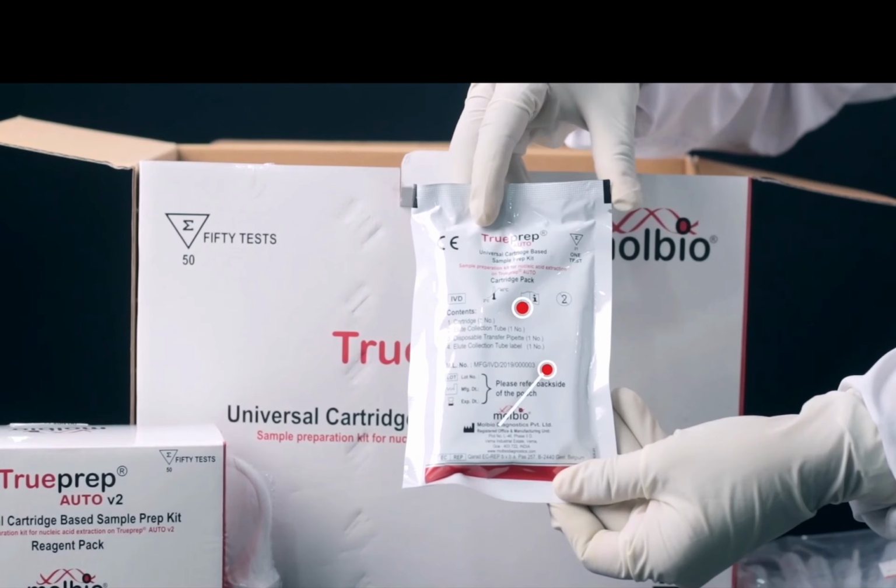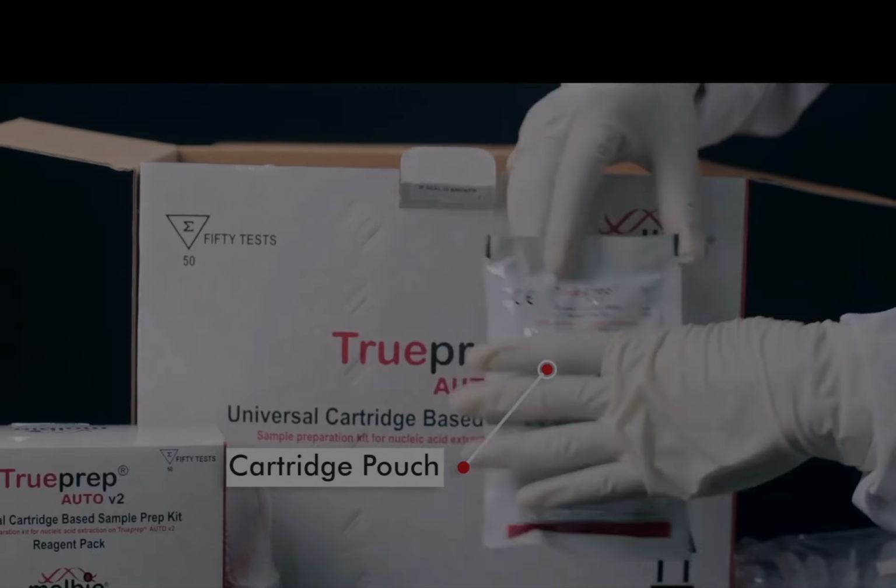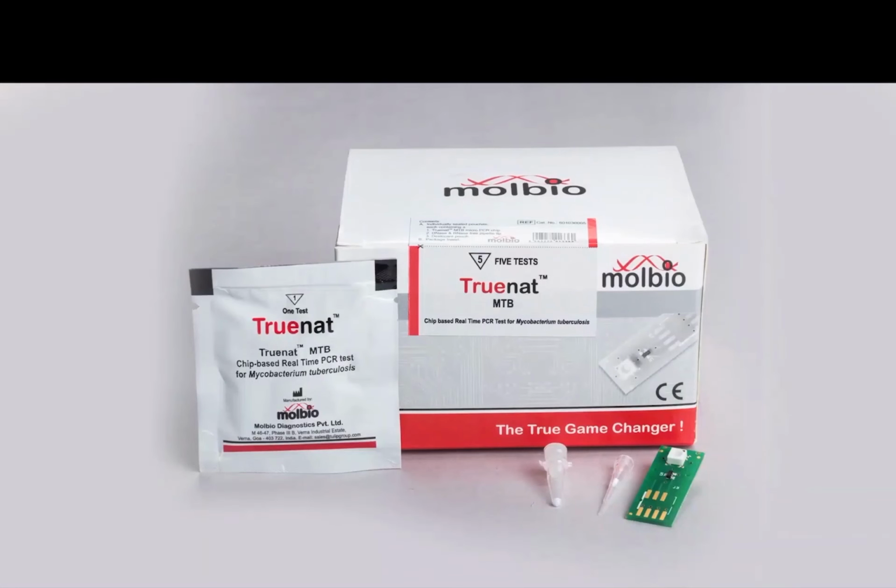And this is the cartridge. We'll be seeing how it looks, a cartridge in which the extraction occurs. Once the DNA extraction has occurred, now we need to do the PCR. It is done in the PCR analyzer machine.